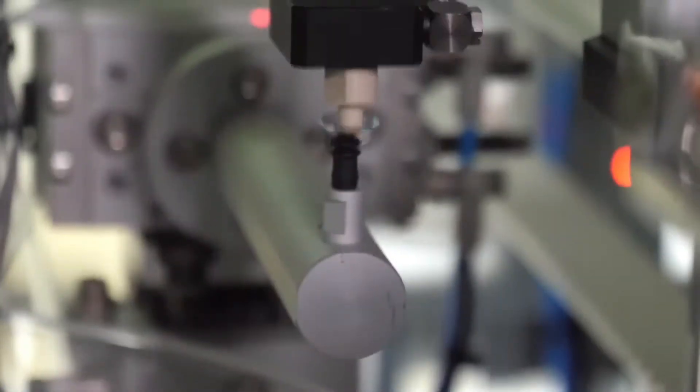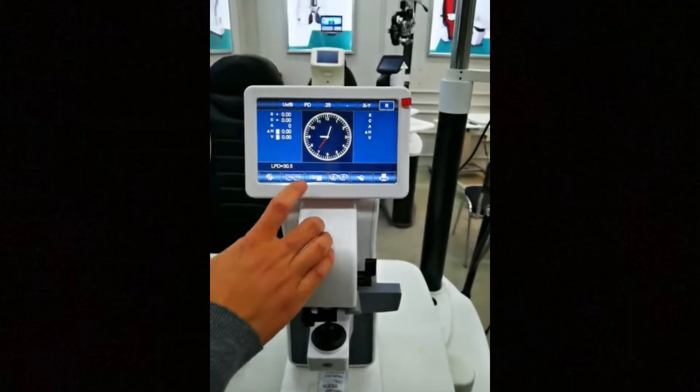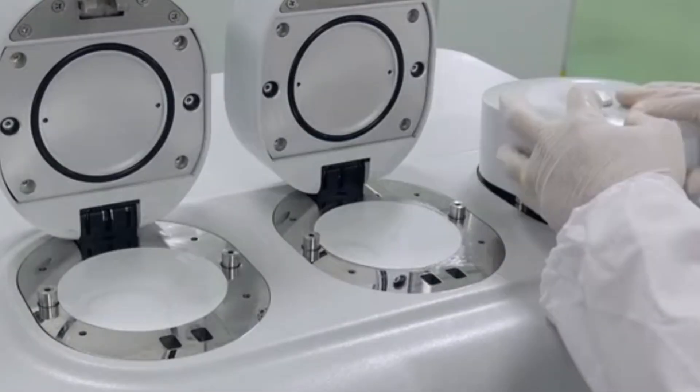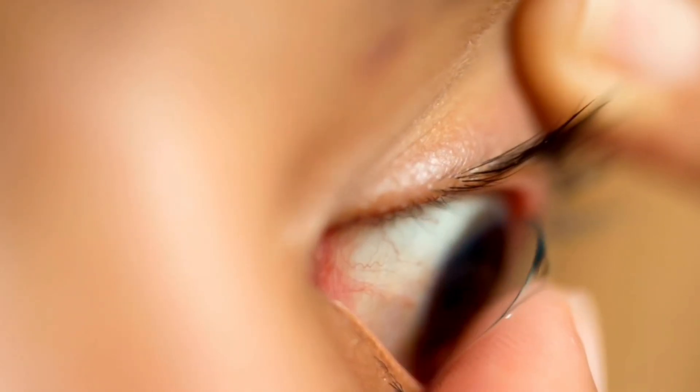Each lens is measured for the correct curvature and power to make sure it actually corrects for the vision errors that it's supposed to. Oxygen permeability testing makes sure that enough oxygen is able to pass through to keep your eyes healthy.